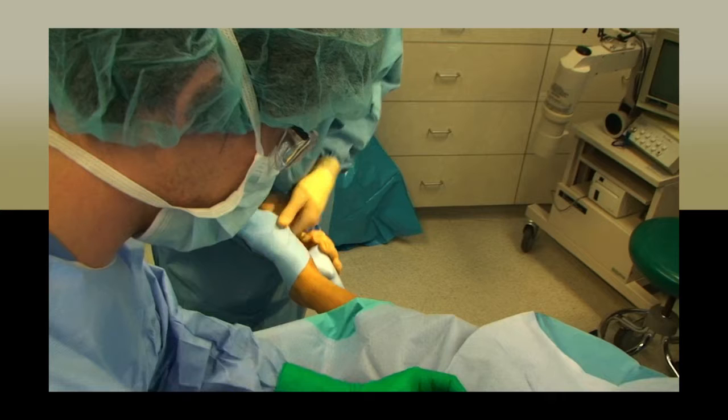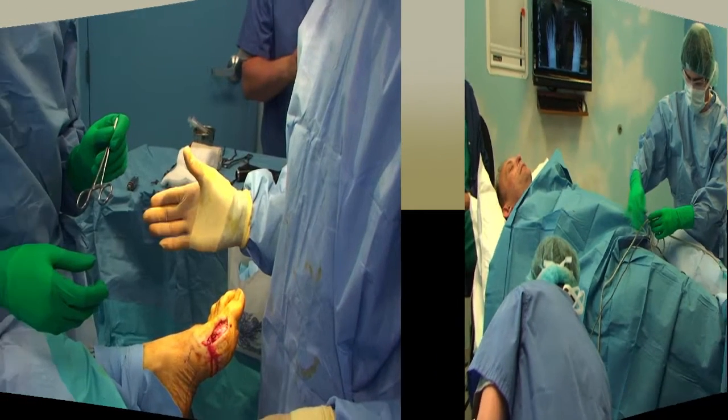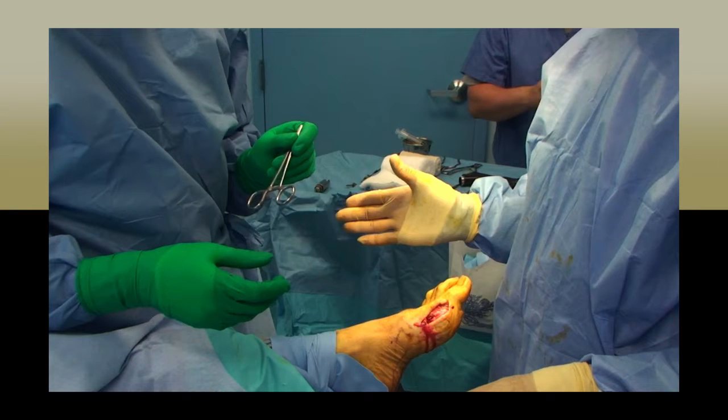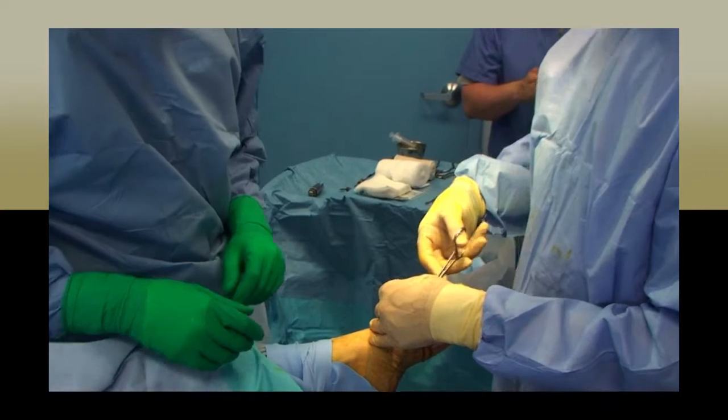When the tourniquet is in place, he will then need his 15 blade and pickups. When passing instruments in the case, you will need to pass them properly and in the position that allows the physician to grab and use the instrument immediately. The surgeon will vocalize what he wants and then place his hand in an open palm handshake position. You will grab the desired instrument and quickly place the handle of the instrument directly and a bit forcefully in the palm of his hand and hold it there until he grabs the instrument from you.